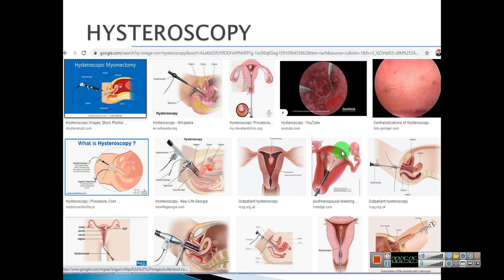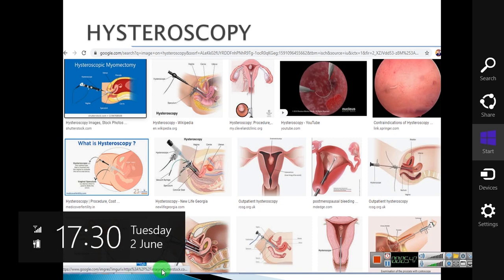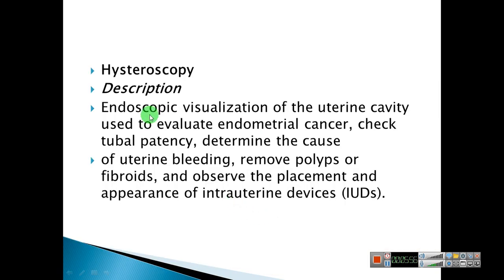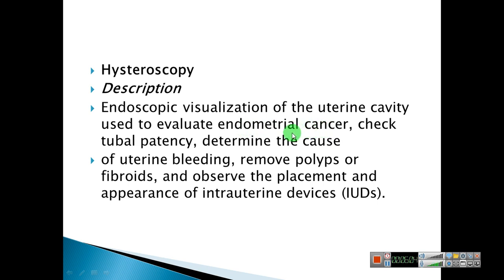Hysteroscopy. These are pictures of hysteroscopy — the instrument is inserted through the vagina and images are obtained through it. Surgeries such as myomectomy can also be performed via hysteroscopy. Description: hysteroscopic visualization of the uterine cavity, used to evaluate endometrial cancer and other uterine conditions.